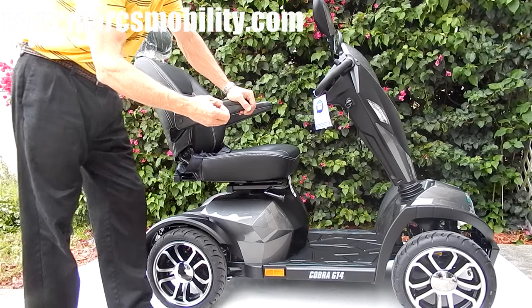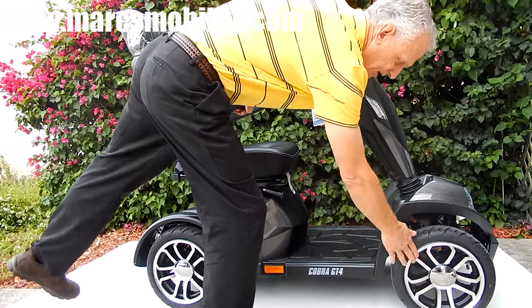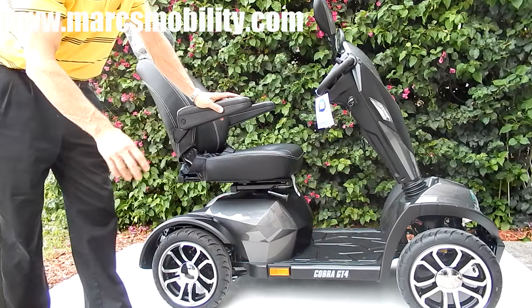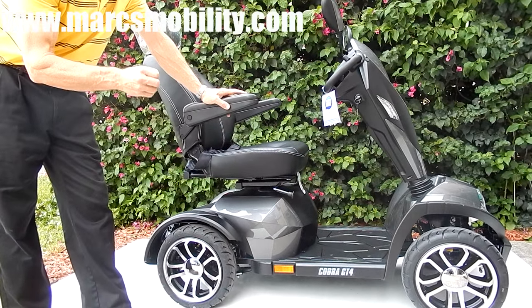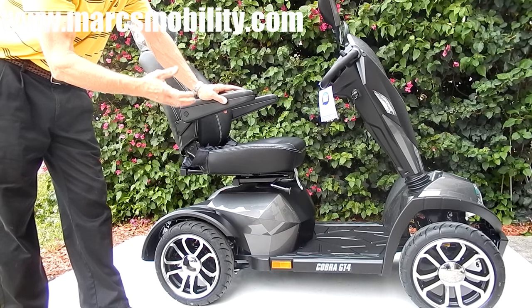Also, this scooter has 14-inch wheels by 4-inch wide — mag wheels, 14 inches tall, 4 inches wide. This scooter has a fantastic suspension. When you're riding this scooter, you feel like you're on a cloud of air.